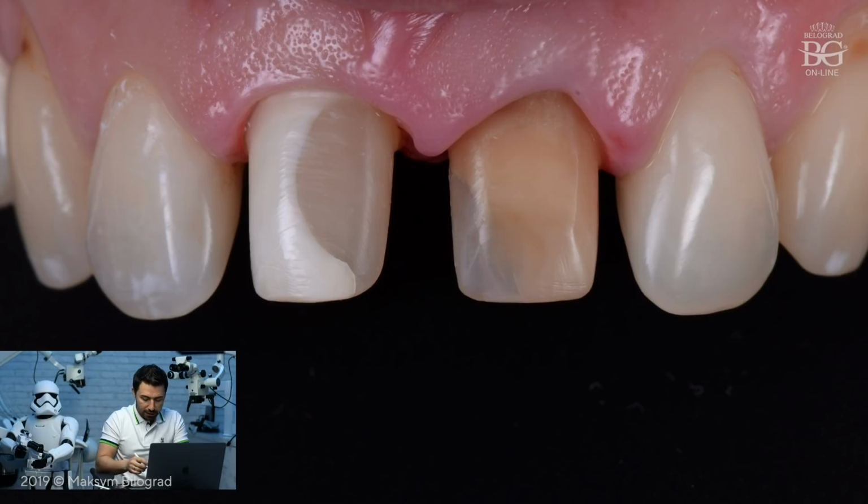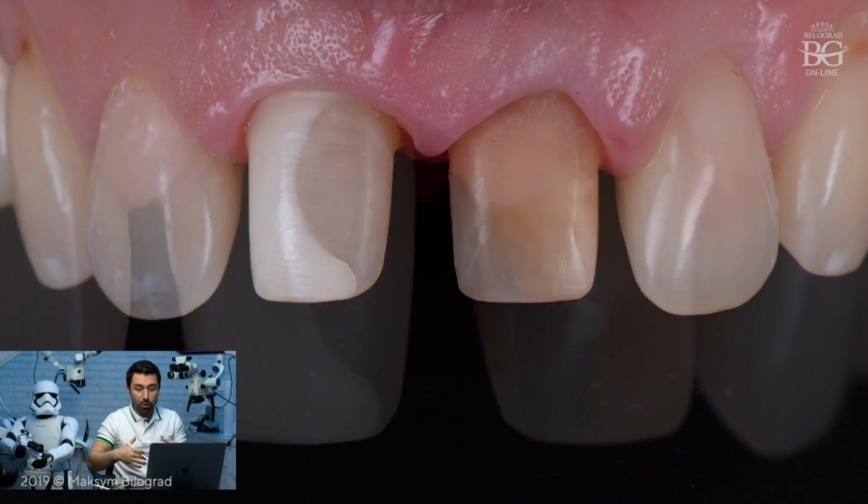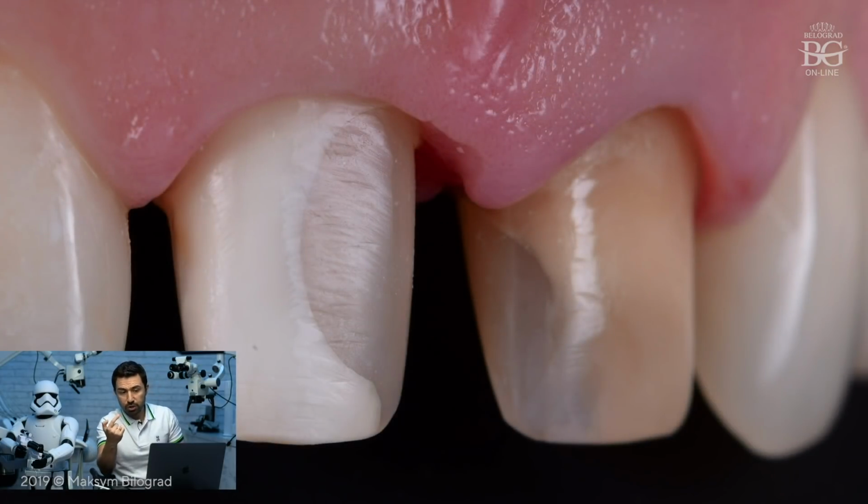In this picture you can see that the gingiva is pink, no inflammation. The interdental papilla is on its way. The level of the finish line is in the sulcus, which is perfect. So that means we are on the right way. And the reason why we are on the right way is that our preparation was precise and our provisional restorations were also precise. So basically we start to win the game for treatment of the biological width.